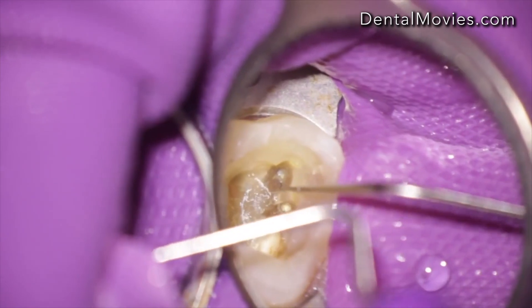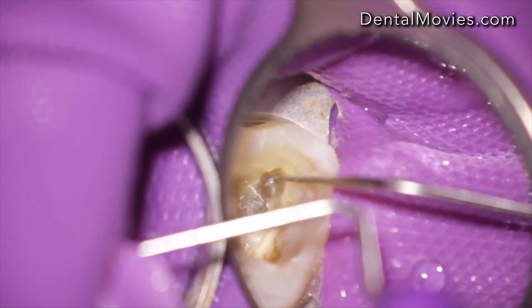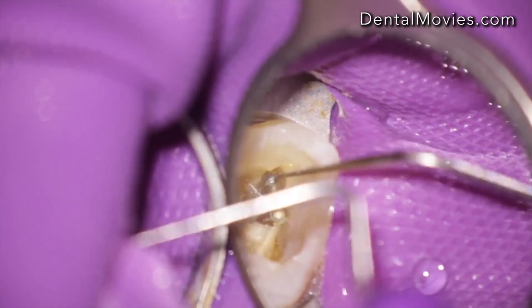It's always a challenge to remove a broken instrument from a root canal. This tooth was referred to our Praxis.